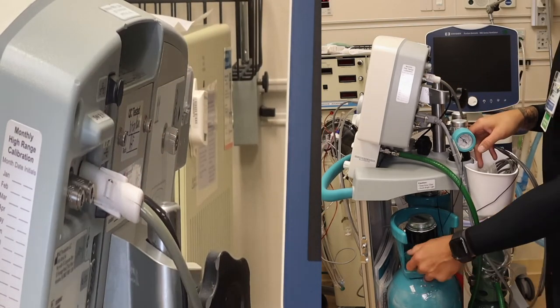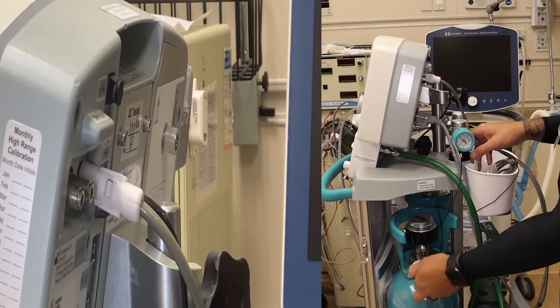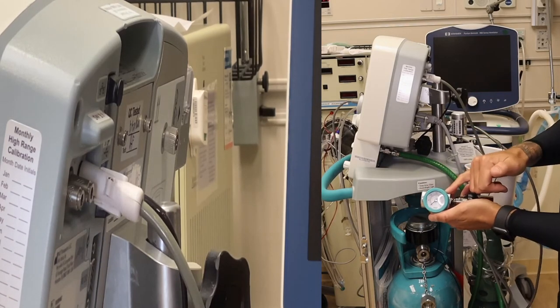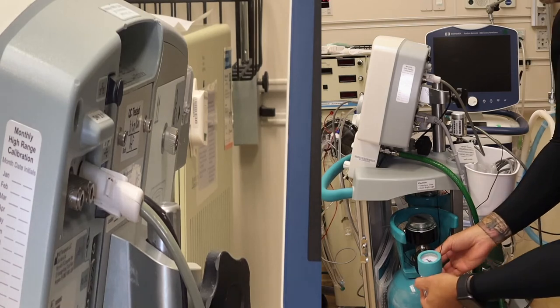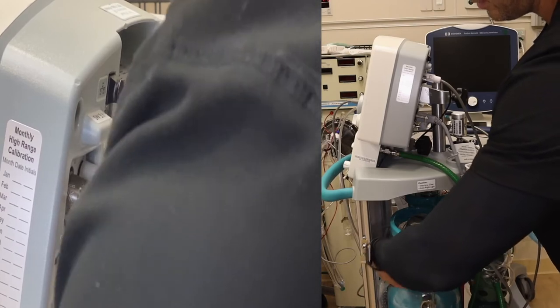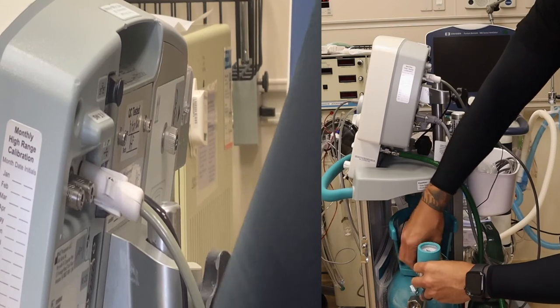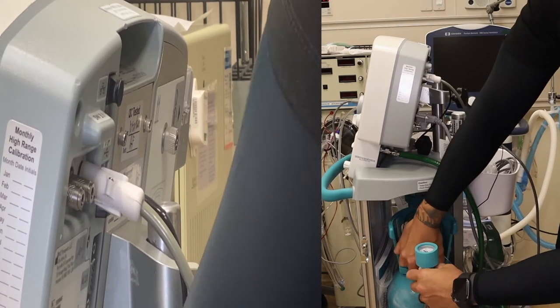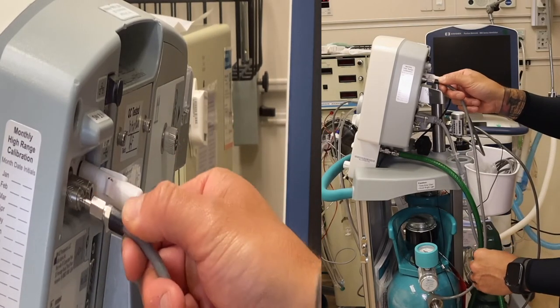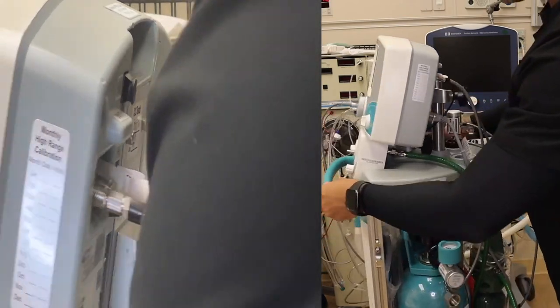First take off the dust cap from your tank, exposing the threading. Grab one of your regulators, which has your pressure gauge on top, and carefully thread this onto your tank. Righty tighty, lefty loosey. Hand tight is okay. Take the regulator line and plug it into the back of the monitor until you hear a click, and it's secured.